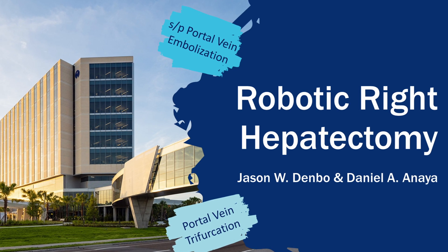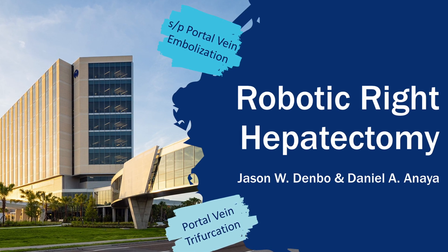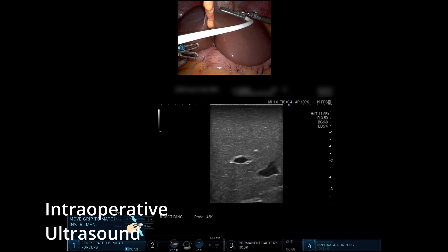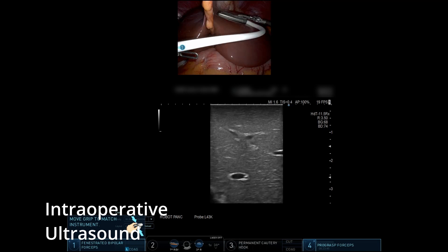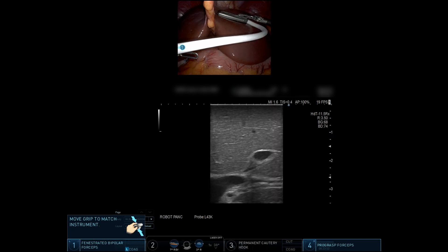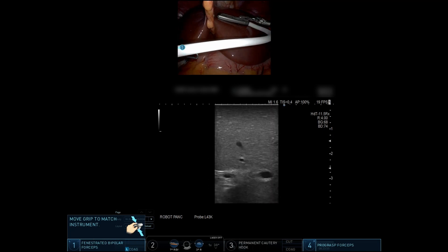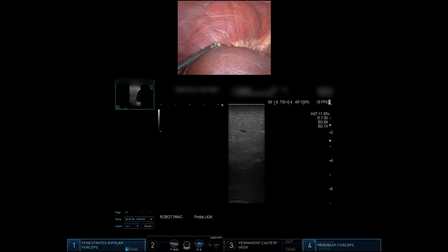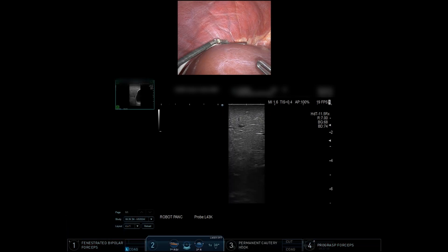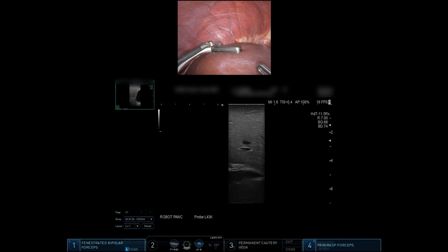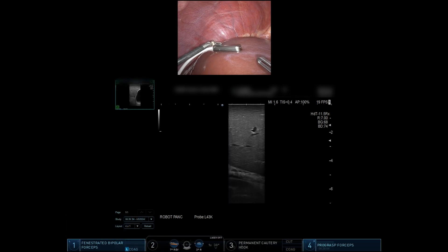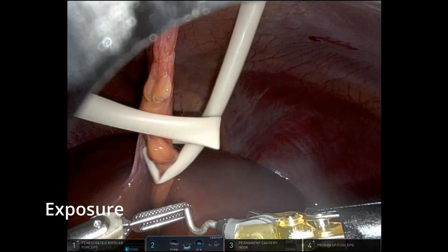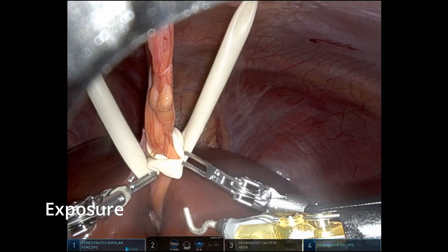We'll jump right in to the surgery. We always start with intraoperative ultrasound to evaluate the anatomy and also look for lesions. Here we are looking for the ablated lesions in segment 2 to make sure they still look treated. Here we're identifying the middle hepatic vein and following it down to the hilum.